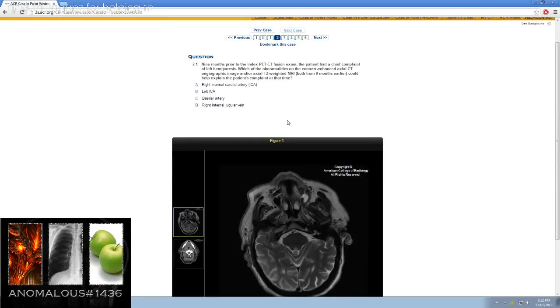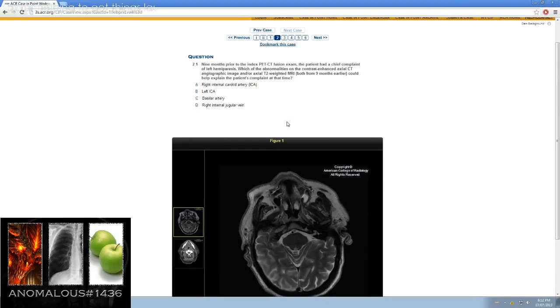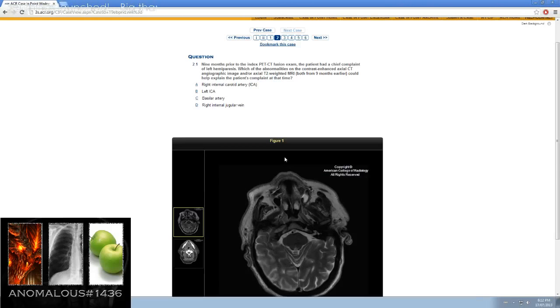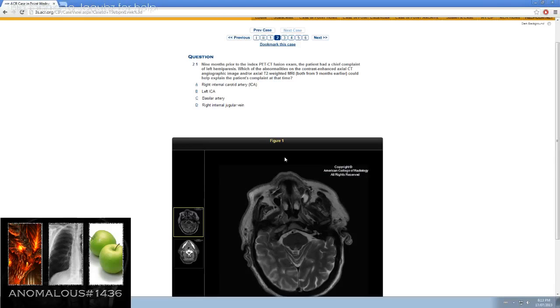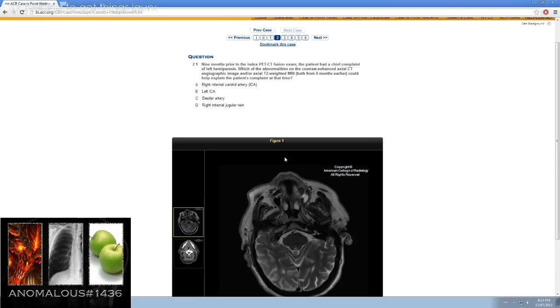Nine months prior to the index PET CT fusion exam, the patient had a chief complaint of left hemiparesis. Which of the abnormalities on the contrast-enhanced axial CT angiographic image and/or axial T2-weighted MRI, both from nine months earlier, could help explain the patient's complaint at this time?